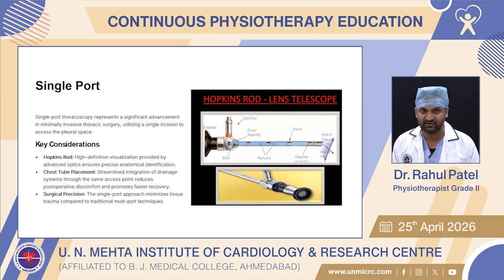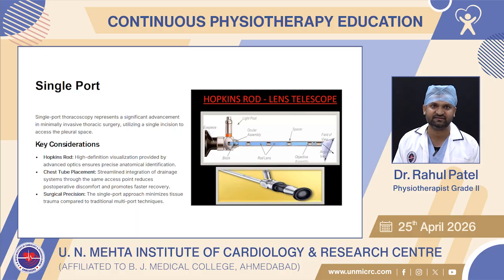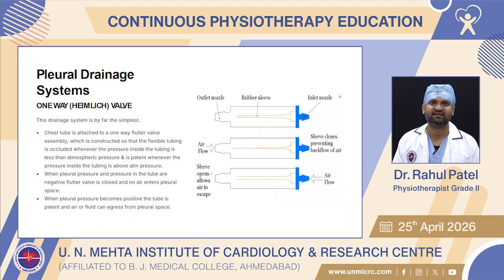Key consideration: the Hopkins rod's high definition visualization provided by advanced optics ensures precise anatomical identification. Chest tube placement streamlines integration of the drainage system through the same access point, reduces post-operative discomfort and promotes faster recovery. Surgical precision. The single port approach minimizes tissue trauma compared to traditional multi-port techniques.